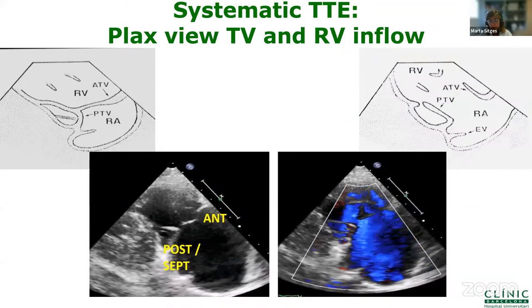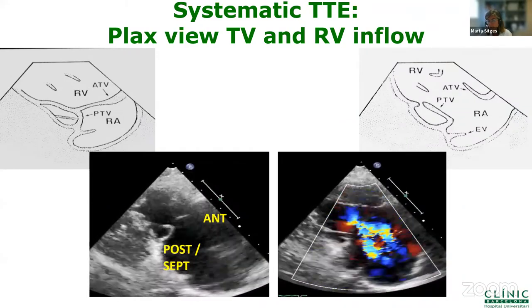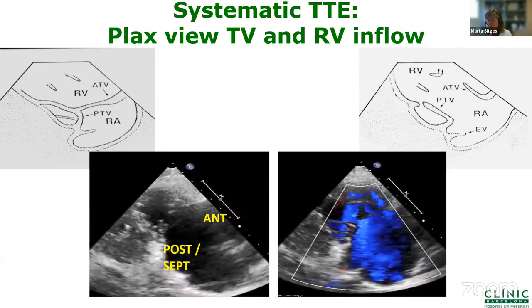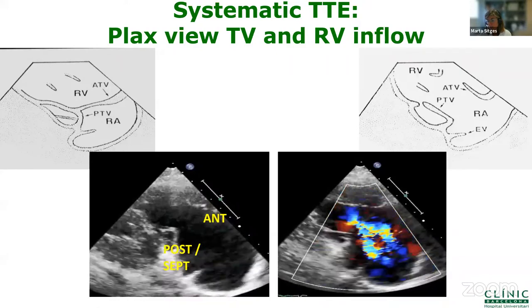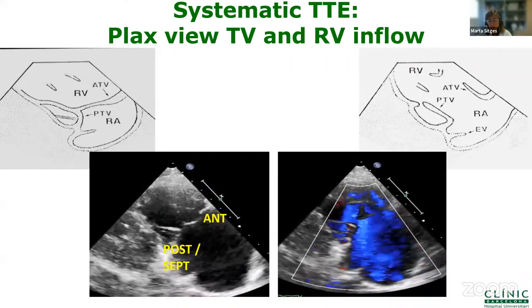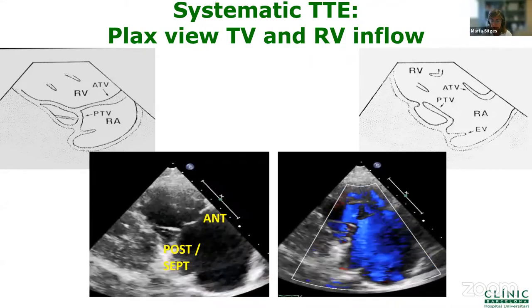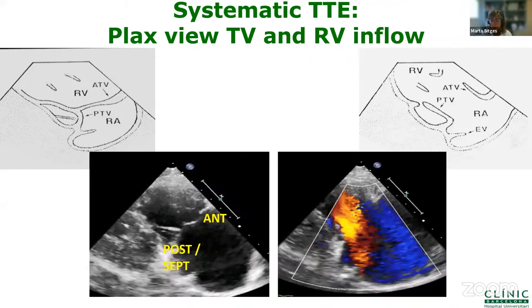We don't have to forget the potential of transthoracic echocardiography. This is where we evaluate most of our patients. They go first to the echo lab, and this is the first place where we evaluate these patients. And really, if we want to have a good interventional program, we also need to not teach, but establish a common language and a common consensus with the people working at the echo lab.